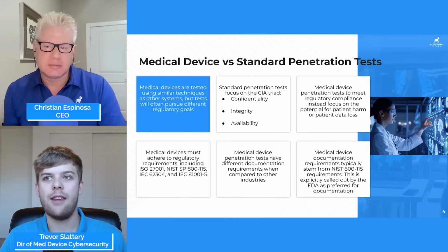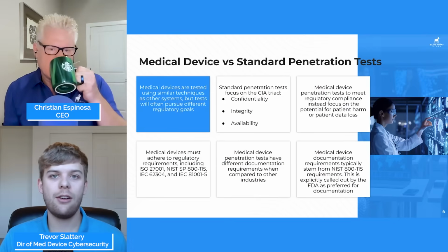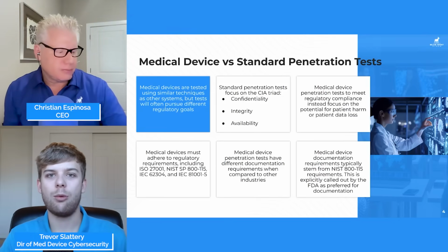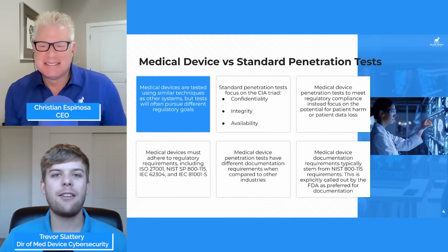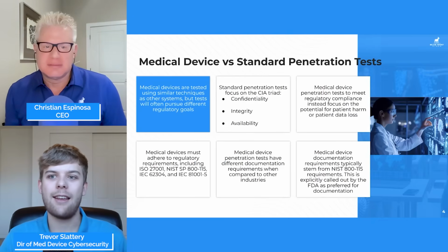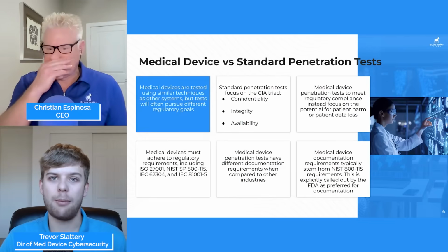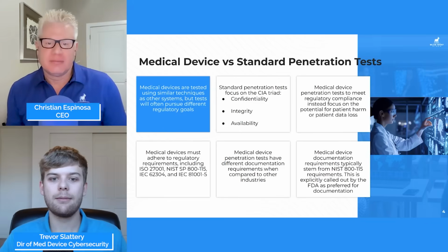These are more focused on the general life cycle of cybersecurity in a medical device, with 62304 being focused on the general medical device lifecycle, software development, product development, security baked in. And IEC 81001-5 is meant to be sort of a global standard for medical device cybersecurity. It doesn't work that way in effect more often than not, as each different country has its own regulations and requirements. But that is the general purpose, to be an overall widespread medical device cybersecurity regulation.